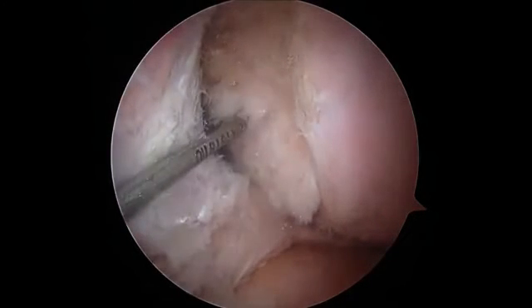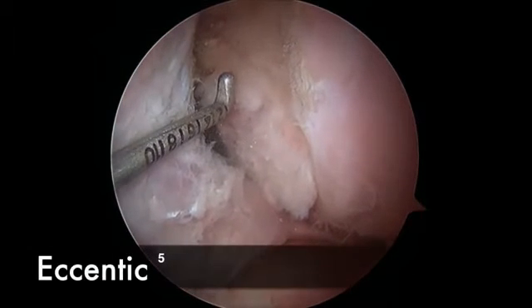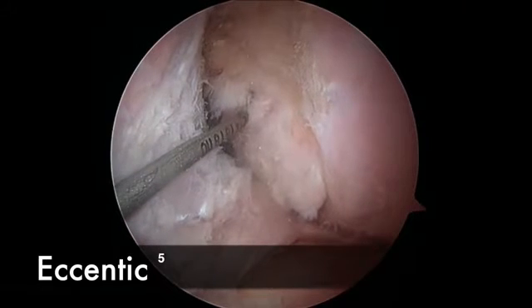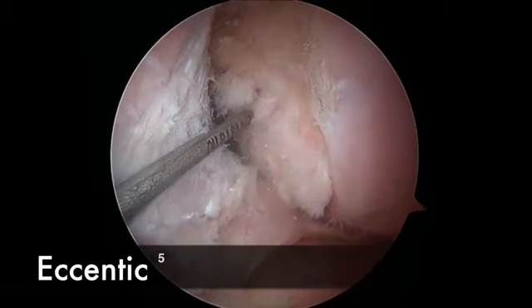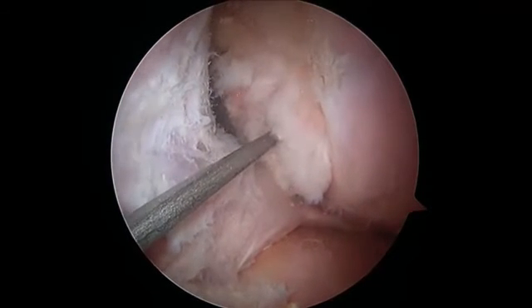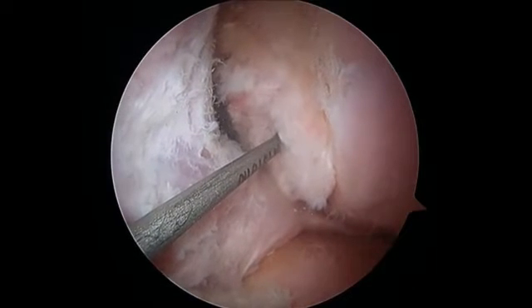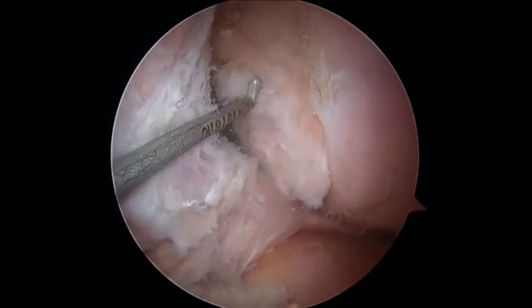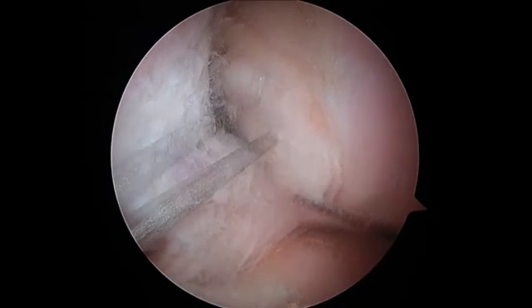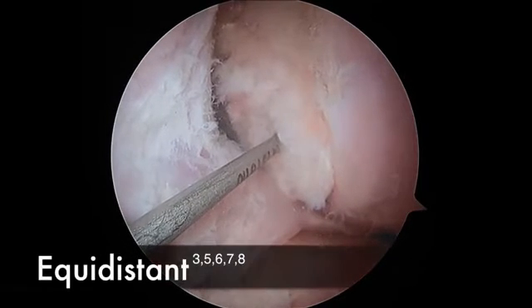The E in ideal stands for two things. One is eccentric. We want our femoral tunnel to be eccentrically located within this footprint. This is a central position within the footprint, but we don't feel that that is an appropriate position for our tunnel. We actually want our tunnel to be slightly eccentrically located within the ACL footprint.